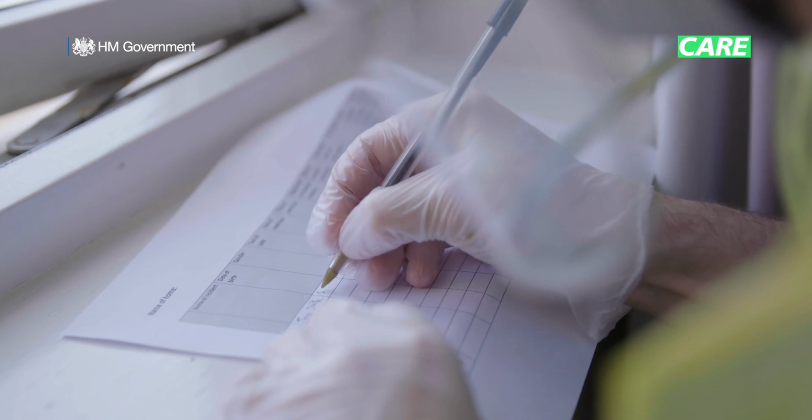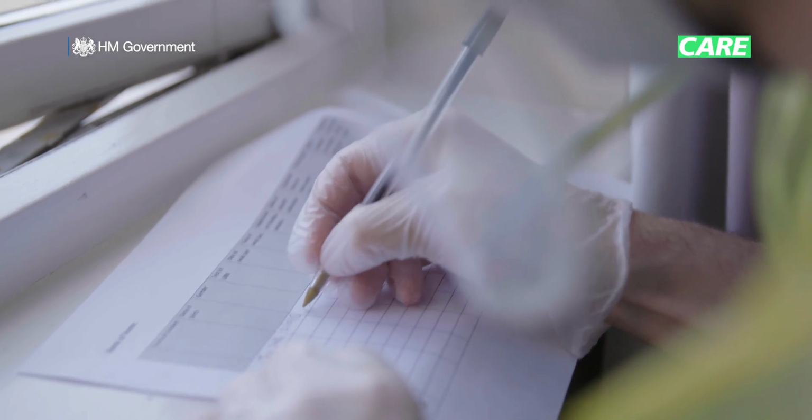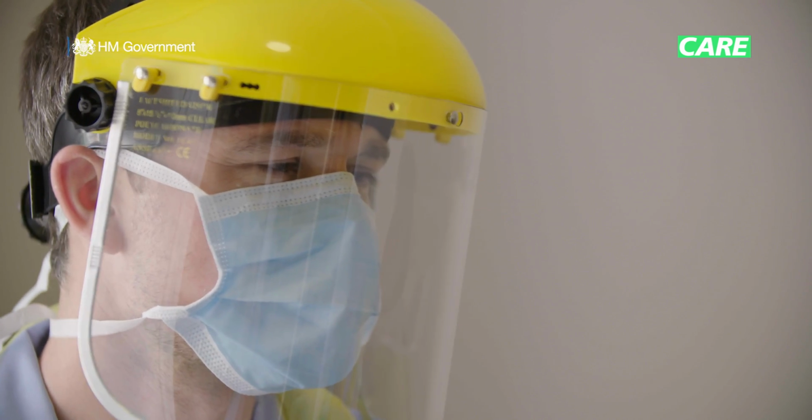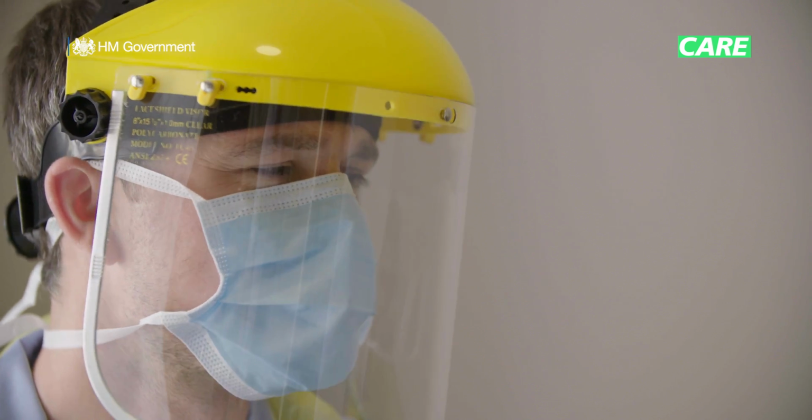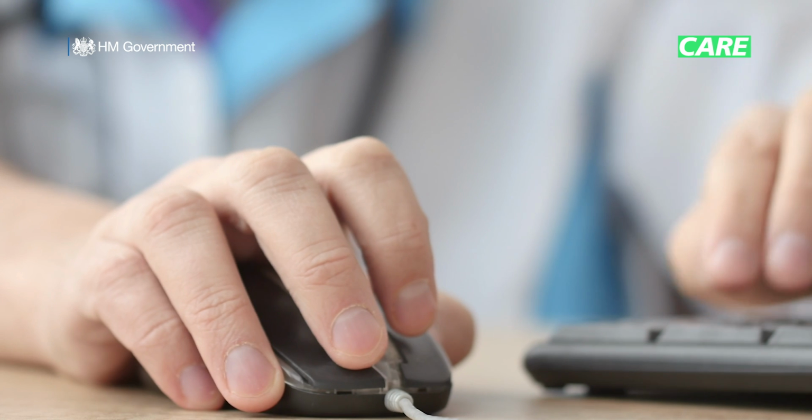Your colleague needs to fill out the test record with the resident's details so you can avoid touching anything. They should take a recording of the time you start each test and log this onto the test kit website later. You're now set up and ready to perform the test.